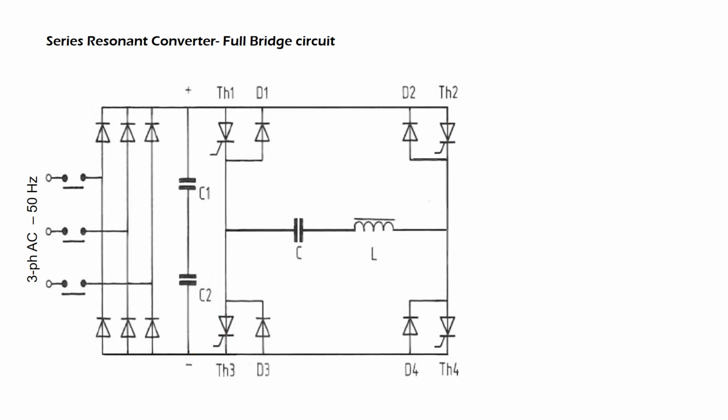When the current crosses zero again, the current is first taken over by the diodes D2 and D3 and, after termination of the so-called recovery time, the thyristors TH1 and TH4 are made to fire again. This procedure can be repeated as frequently as desired.